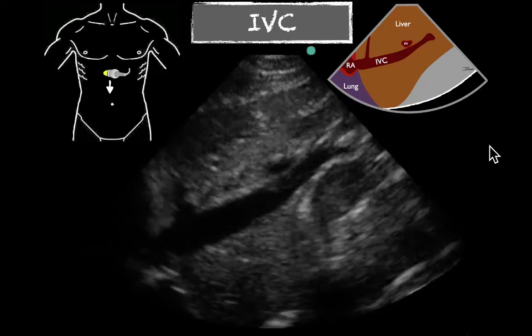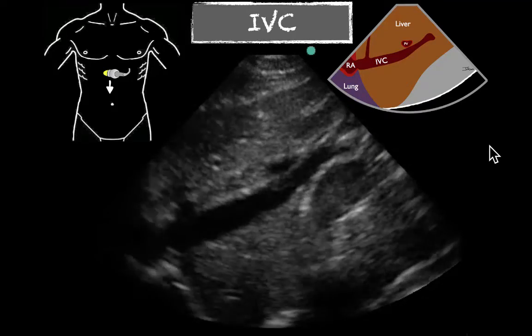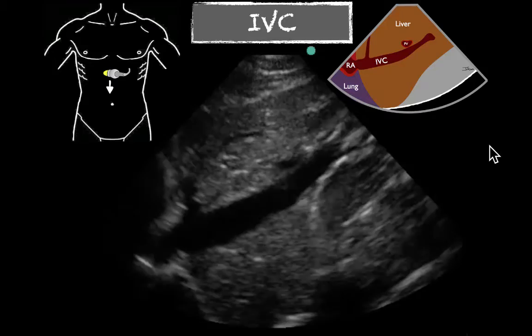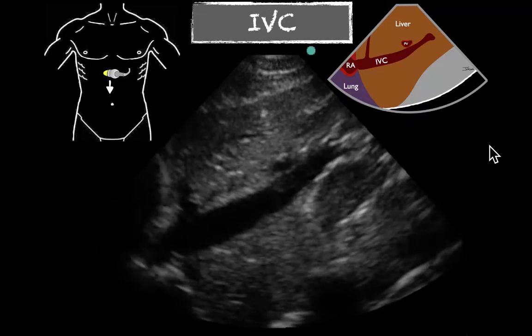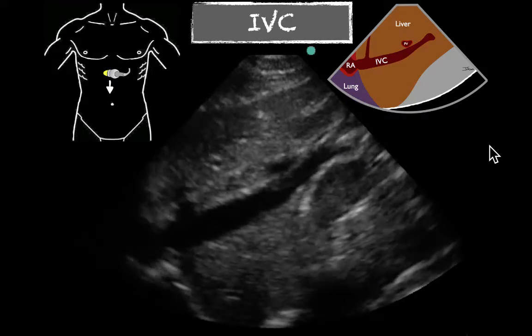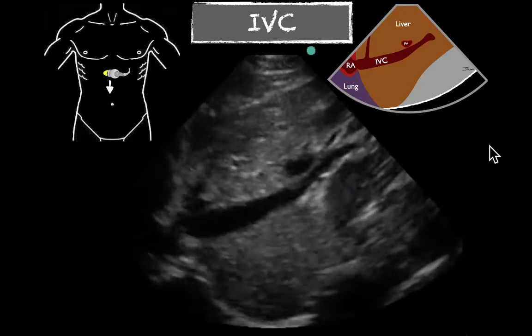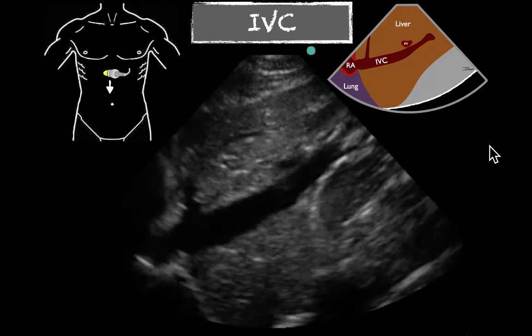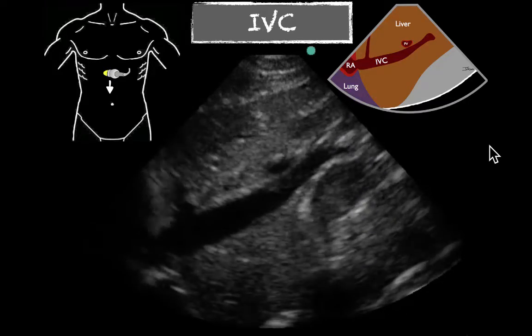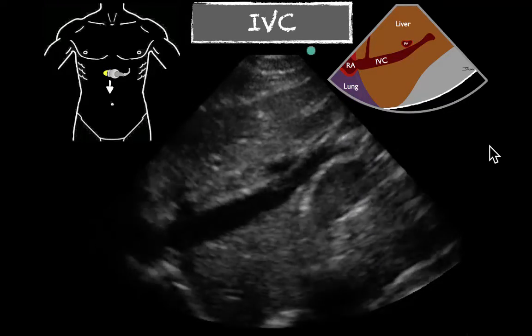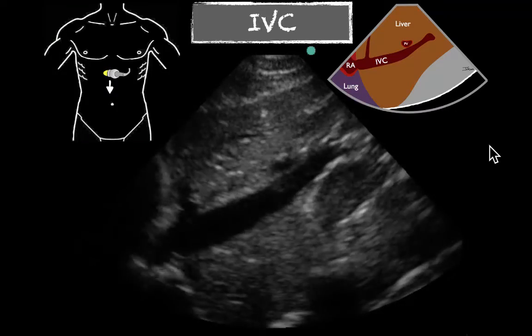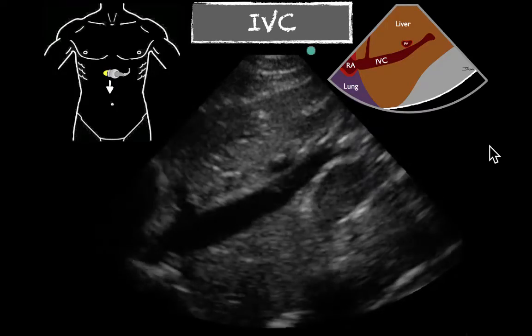When you look at the tables that give you your percent variation with what your CVP is, this probably puts you in the range of 5 to 10, possibly, because you have a distended IVC with some collapse.